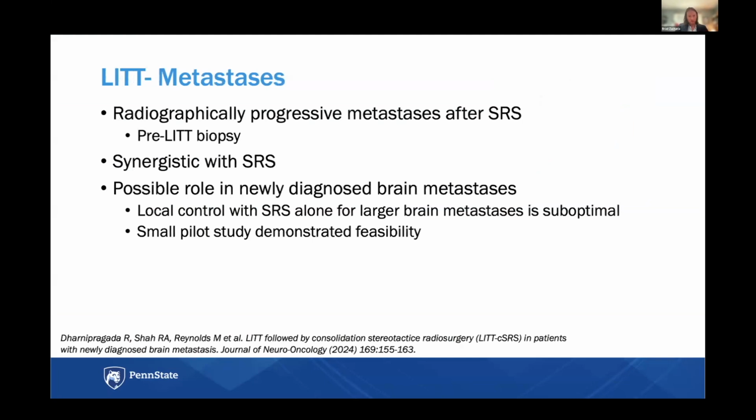And so just briefly, I'll hit on some of the key things in the literature. So it's utilized for metastases. It's probably its bread and butter, most common indication: radiographically progressive metastases after SRS. You could do a biopsy to confirm whether there is in fact tumor progression versus radiation treatment effect. It can be synergistic with SRS. There's even a possible role in newly diagnosed brain metastases.